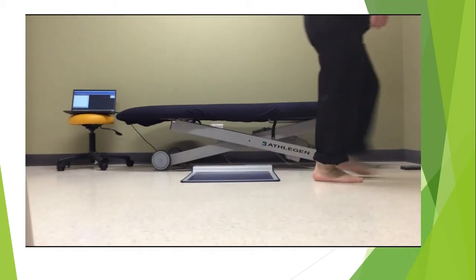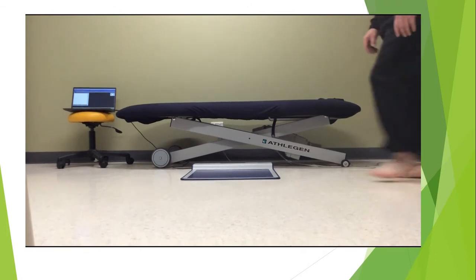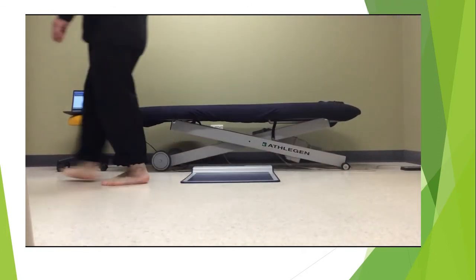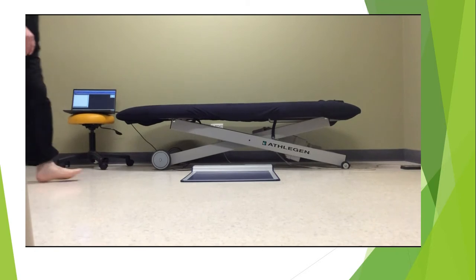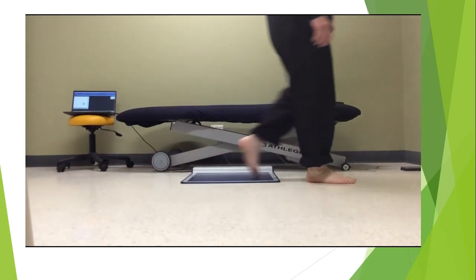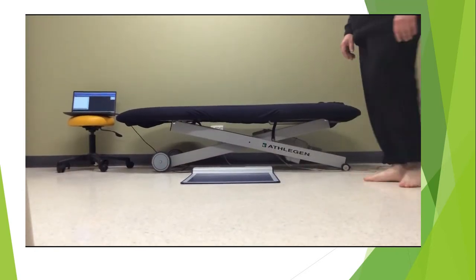So to do that, we're going to use this 65 centimeter square mat. Our patient, we're going to walk them over the mat. We're going to capture five steps of the left foot and five of the right.